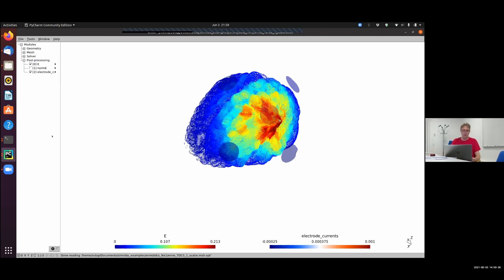There's one more. As far as I see, SimNIBS uses fixed conductivities. Can those be modified? And I guess that's a good point to hand back to Oula, who can first of all again show the results of this scripting simulation of this 4x1 montage, and then also briefly show where you can set conductivities in the graphical user interface, for example. You can also do it via scripting easily.